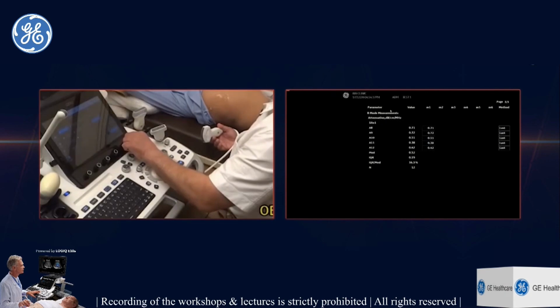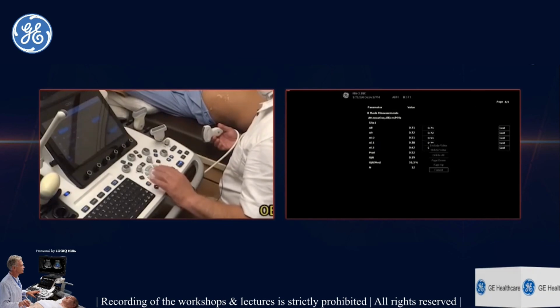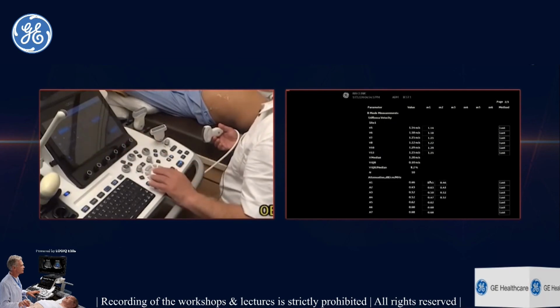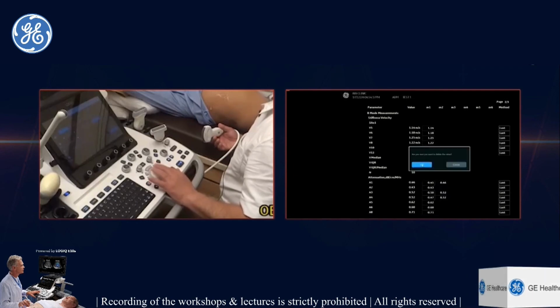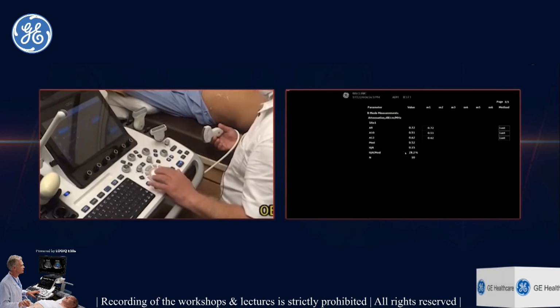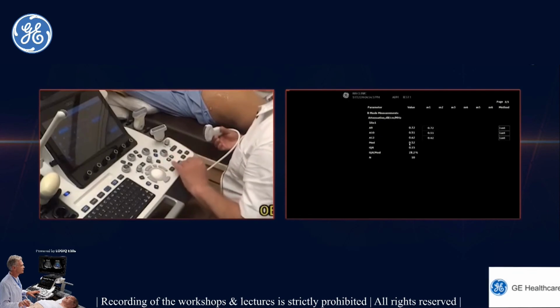We can delete some extremes again here, two on either side so that the median remains appropriate, and we've got an IQR median ratio of about 28%, less than 30% acceptable, and the median is 0.52, which is just above the normal range, so probably just S1 steatosis, and of course we'll talk about this.